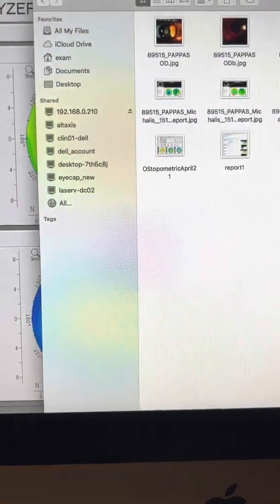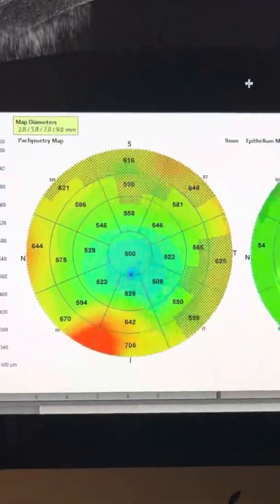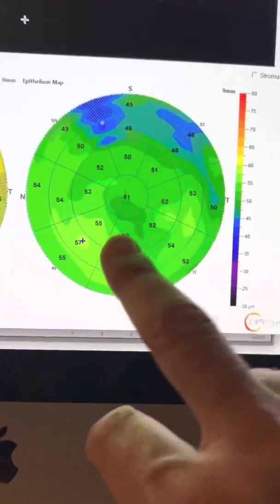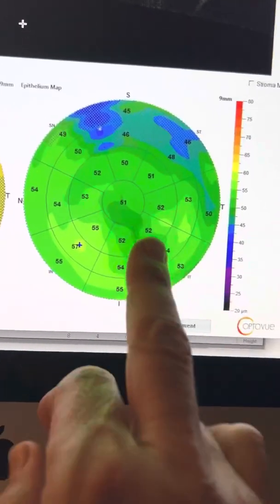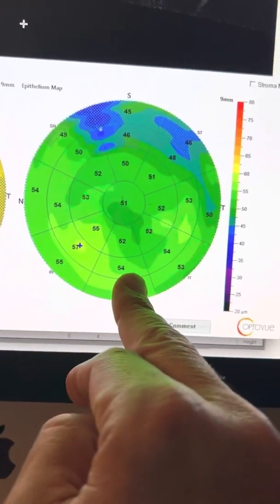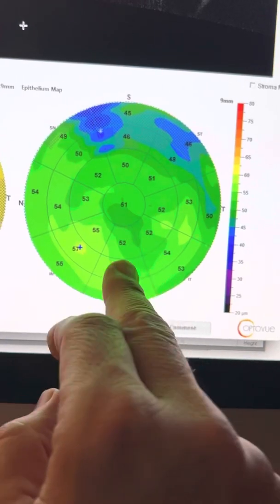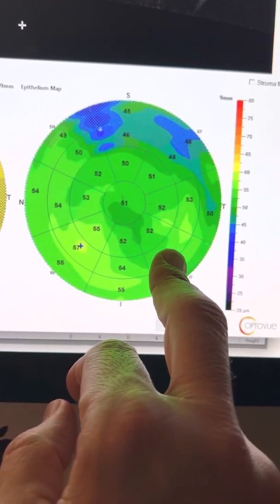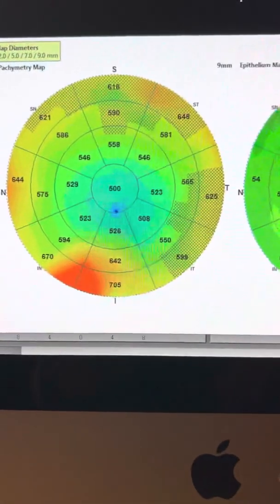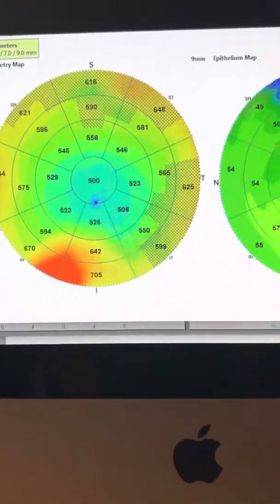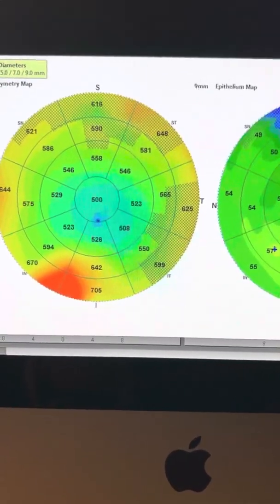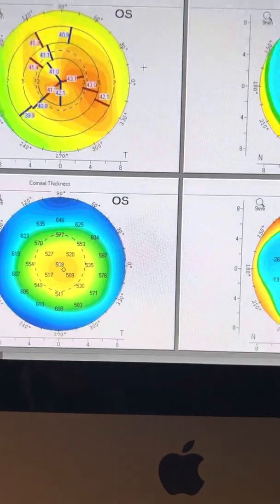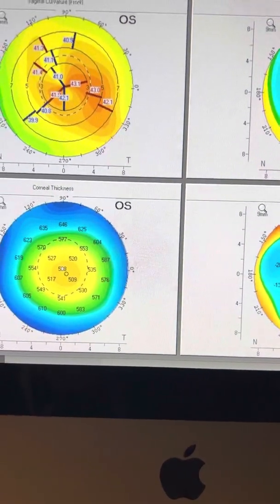We will follow though the Pentacam maps at a six-month interval. And as we have discussed for us, it's even more valuable following the epithelial maps of this left eye, because the epithelial maps may change significantly and in a way to keep the curvature maps stable and hide a significant keratoconic change from evaluating it purely with the curvature maps and visual acuity.